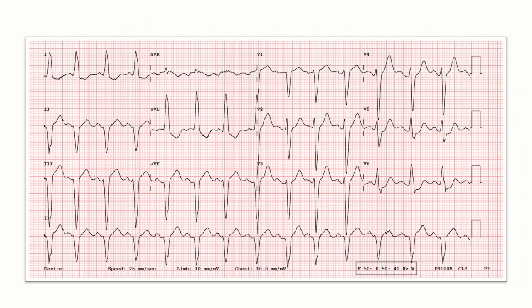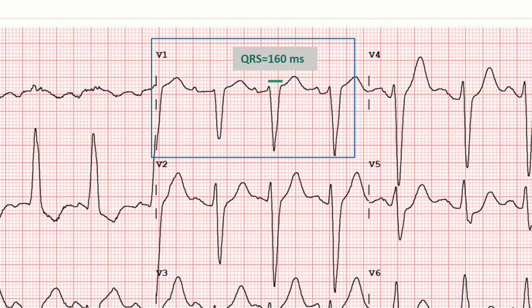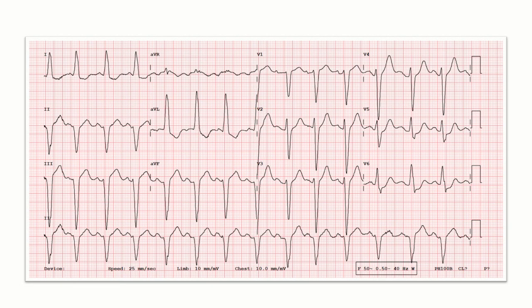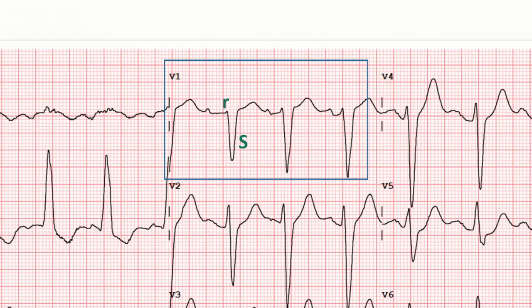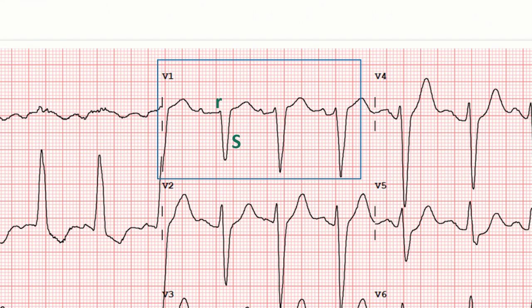Coming back to our ECG, here we can see that QRS duration is more than 120 milliseconds — it is almost 160 milliseconds. This ECG has small R waves and large S waves in V1.